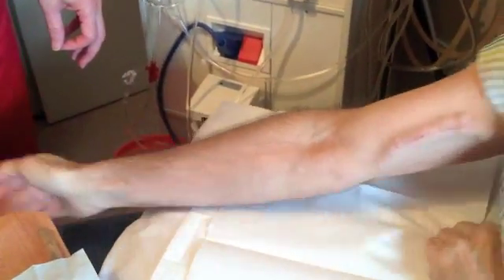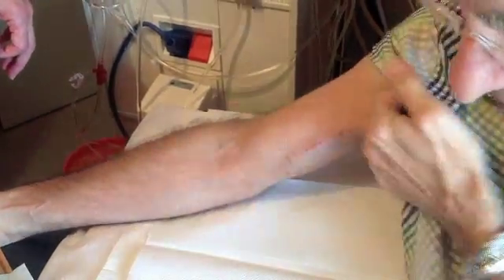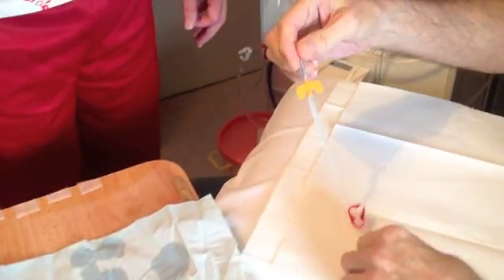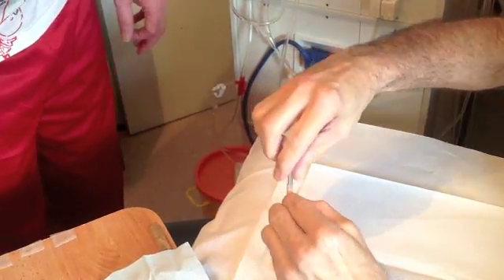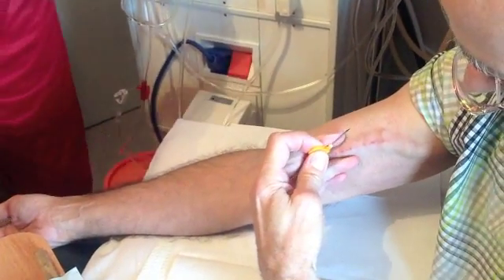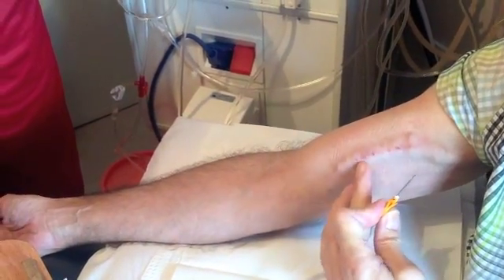Alan is now going to self-cannulate, or self-needle, whichever you wish to call it. He always does the red one first. Taking the needle and removing the cap, and just checking basically the fistula as to where you're going to be putting this.